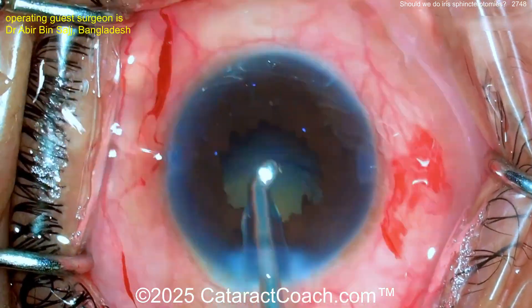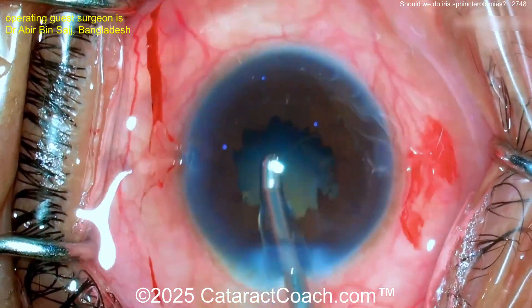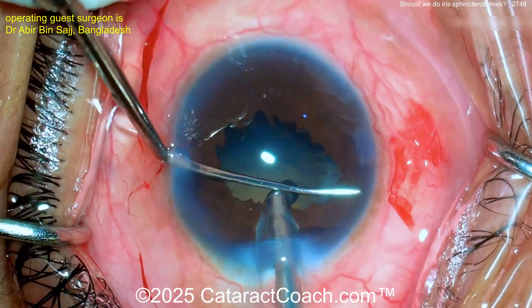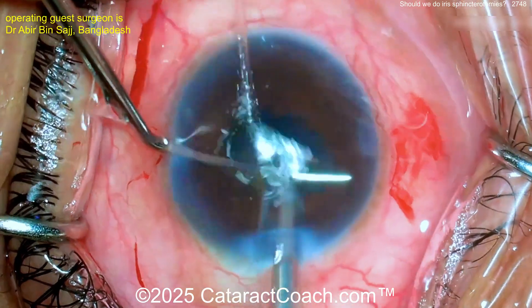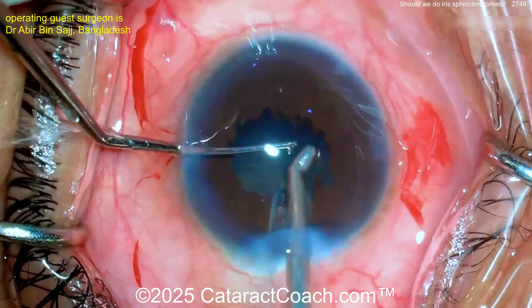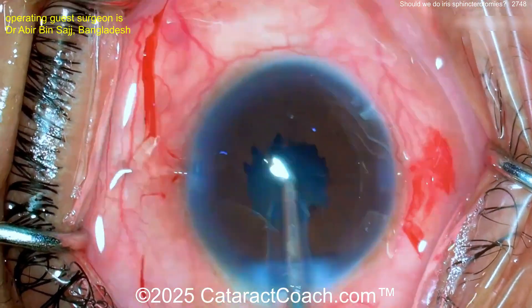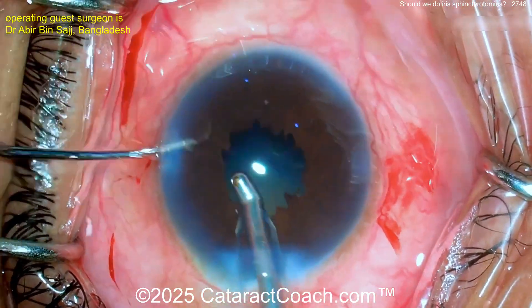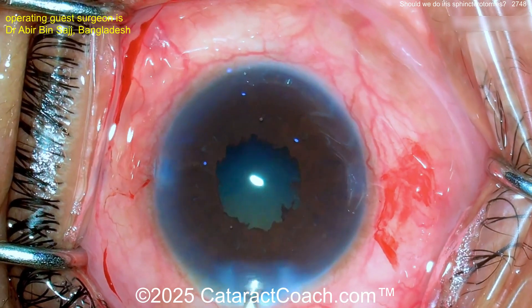It's certainly a technique that has usefulness, but you've got to weigh the benefits versus the compromises. The compromise here is a cosmetic defect — you're not going to have the prettiest looking iris. Here's the surgeon using a second instrument to lift up the iris — I like that.